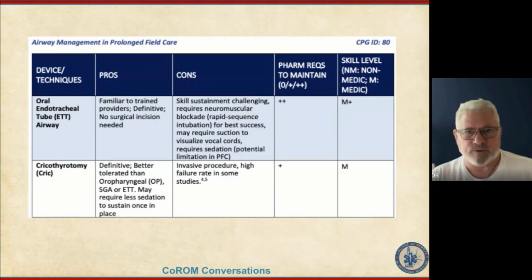But if you're going to do rapid sequence intubation, you have to learn how to use a laryngoscope. You need to have the strength to lift the jaw. You need to position. You need to give medications. You need to know how long to wait before those medications are effective so that you're not still fighting the patient. Have you given them the paralytic? All of those components. So when you line up the tasks involved in doing a rapid sequence intubation versus a surgical crike, the surgical crike has a shorter list.